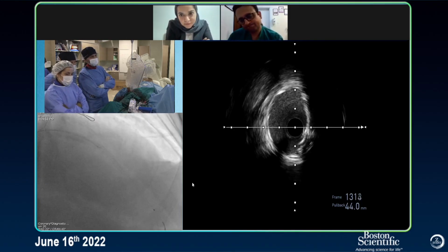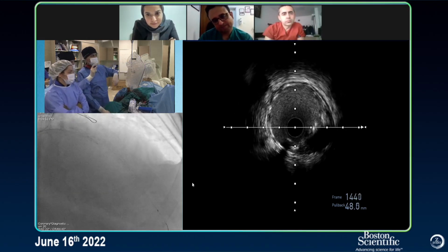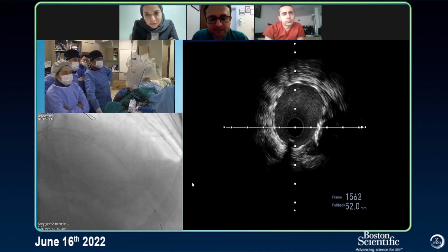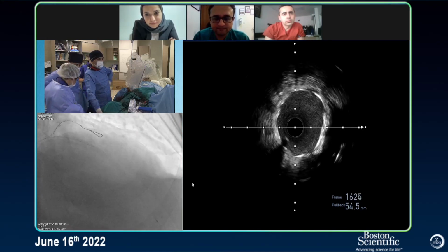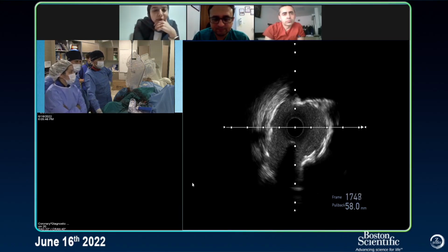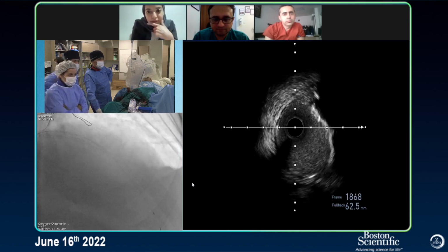This is eccentric. Which part is this? It is the middle. Yeah, middle. This is the first, middle. Just below the diag. Now opening is okay. And you can probably check the MSA if you hit it one more time with a 3.5 and a 4.0 proximal. This looks actually really good, by the way.